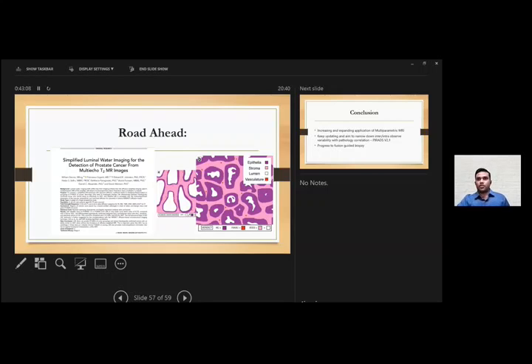So there is fluid which is secreted by the stromal and glandular tissue, and is surrounded by the stromal and glandular tissue. As malignancy progresses, the water content within the tissue decreases, and so it will give a darker signal in this simplified luminal water sequence. This is in the experimental stage, and they have tried out just basic studies on this.